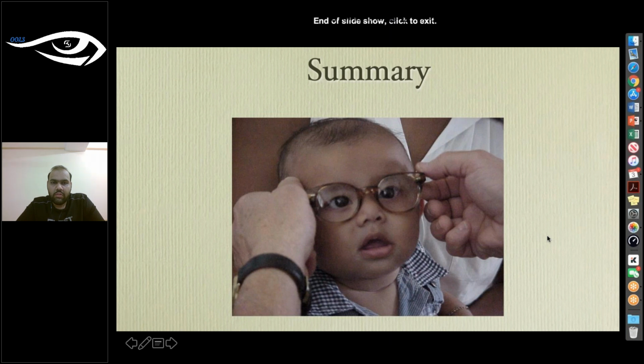So as part of that, my group and others around the country have really begun trying to think about how we can screen that population, not only of high-risk kids, but of normal risk kids. We have been working on this issue, and other groups have, and a lot of attention has been paid to these photo screening techniques. Nice and simple, not inexpensive, they're $7,000 US, but do they work? And the indications are they work okay.